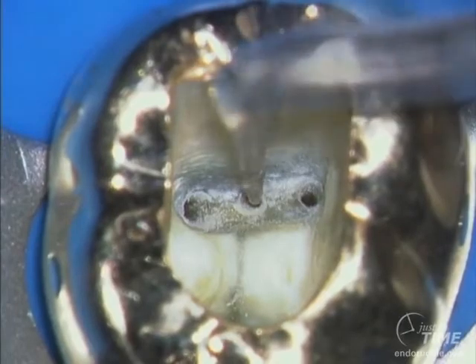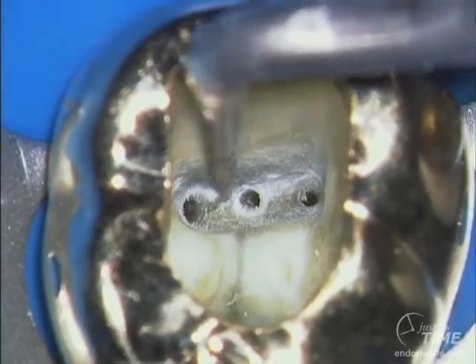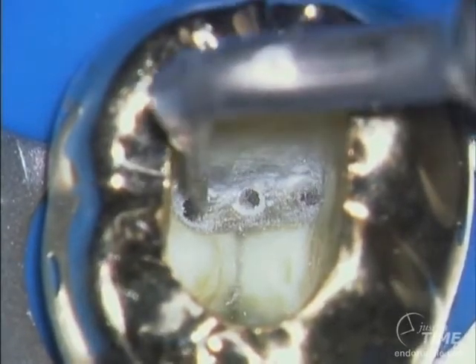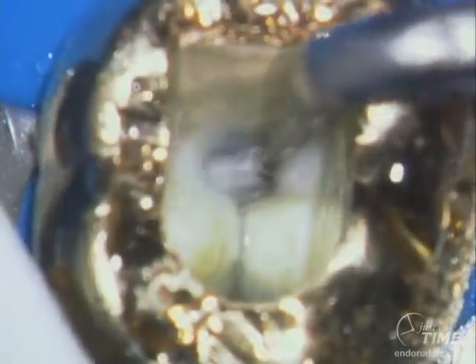Ultrasound can smooth and refine and do precise amounts of detailed work. Reserve your tapered diamonds for doing larger work. There's water port technology if you prefer to cut wet and float and surf out some of the remnants of our work. In the postoperative film, you can observe straight-line access, and you can see the mid-mesial is in fact, along its entire length, prepared slightly smaller than the adjacent systems. So in this five-system molar, we have a great setup for long-term success.